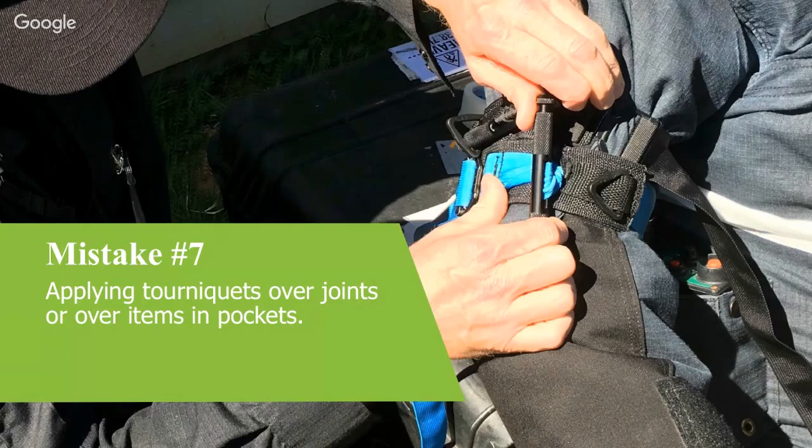You should carry them. Chris recently had a windlass break on a CAT, no longer able to tension it. You're right, mate, that's a throwaway item. That does happen. It shouldn't happen as much with the newer generation, the thicker windlasses. The SOFTT has the aircraft aluminium windlass, as seen in the picture in front of you there. They're not going to fail in that manner. Sarah, yes, we do prefer soft over CAT for that reason.